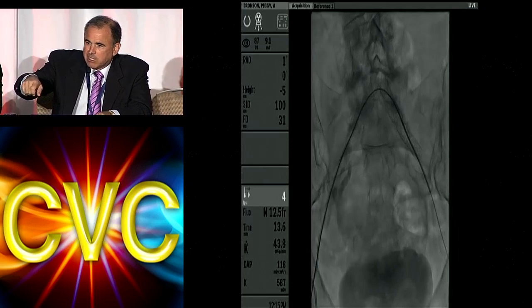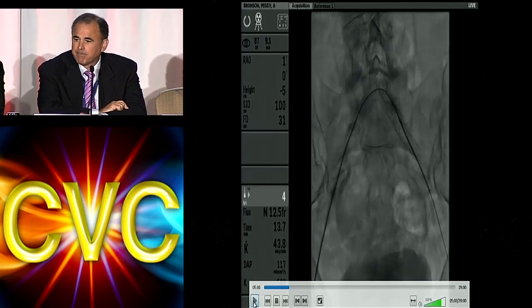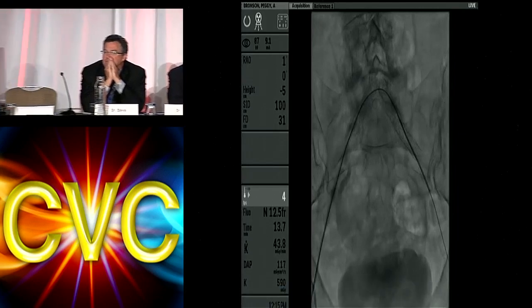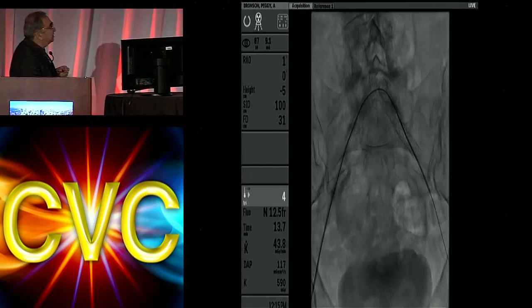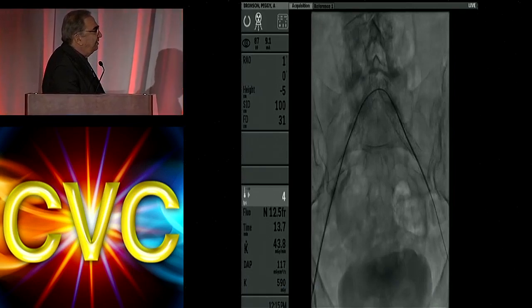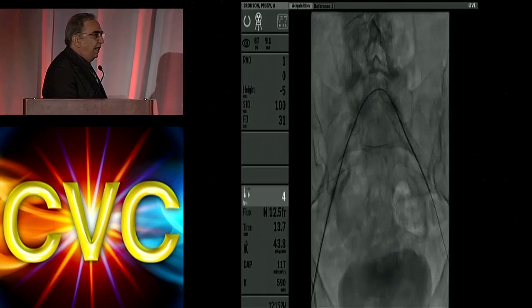Can you stop the tape now? The problem is the catheter is really caught on this. Let's take our wire right back over here. Regardless of what side we go, you have this problem right here. When I pull, you can see that.